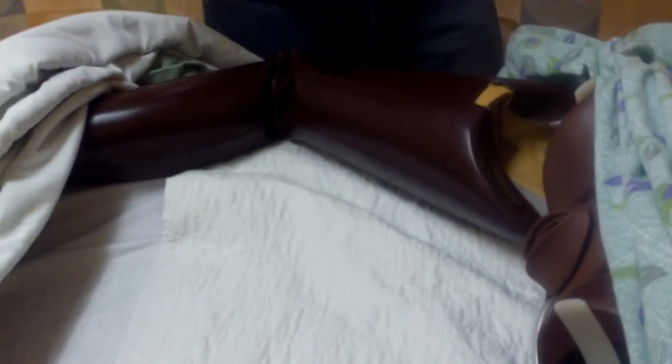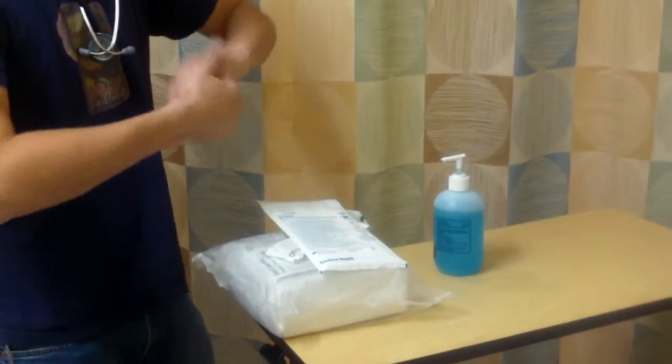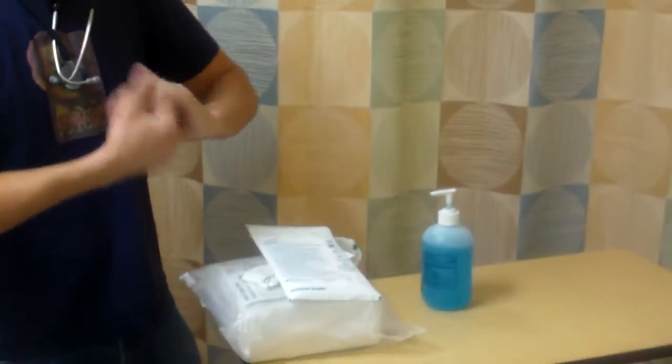So then after I did pericare, then I would go ahead with some more hand hygiene after all that, and I would document everything that I did. So now I'm ready for the Foley catheterization.